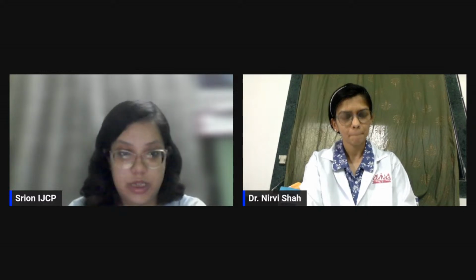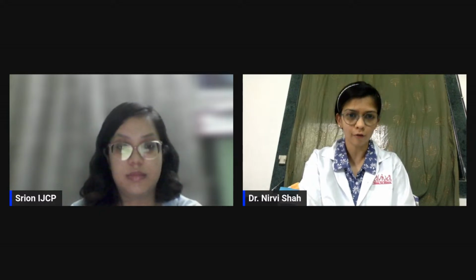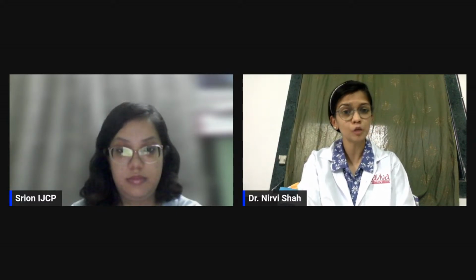Ma'am, there is one last question. How does USG compare with other imaging modalities like MRI or CT in evaluating menstrual disorder? Yeah. So obviously MRI and CT in cases like endometrial carcinoma are better. In Asherman syndrome, hysteroscopy and hysterography are better. The first line for imaging is always TVS. However, in endometrial carcinoma and endometrial hyperplasia, MRI and CT have a role to play.